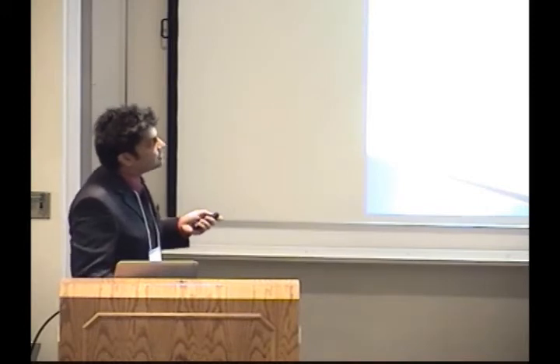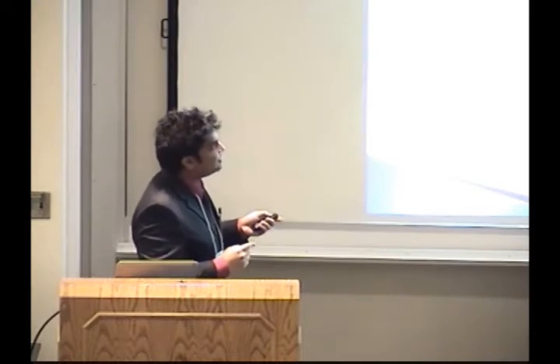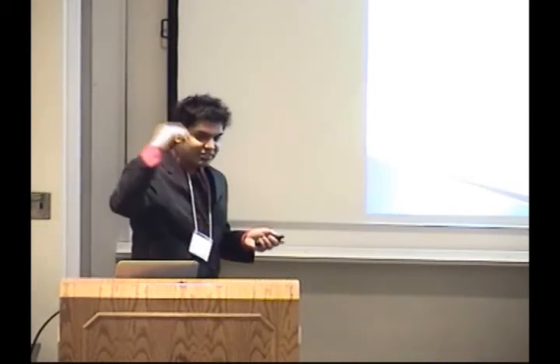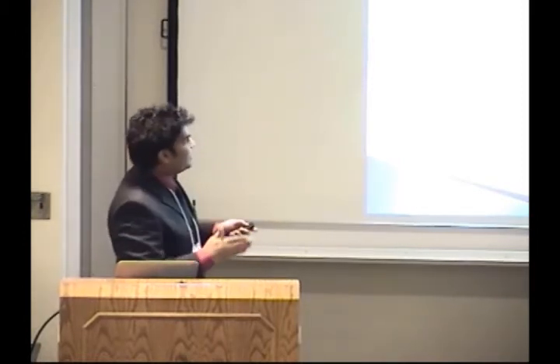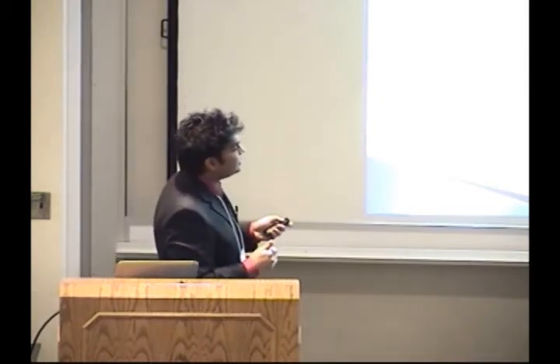So classification, like I said before, we take the ratios of the signal at 10, 11, 12, and 13 hertz. So you saw that huge peak, and we take the mean power from 9.75 to 19 hertz. The reason we chose that range is because below 9.75 hertz, you'll see a lot of random activity from the brain. So that's where mu rhythms are found, and alpha rhythms, and a bunch of other brain activity. So we don't want that to muddy up our signal. And then 19 hertz, we stopped there because sometimes you can see harmonics from these signals if they're elicited. So if you get a harmonic on a signal that you didn't want to look at, that could kind of screw with your ratio as well.